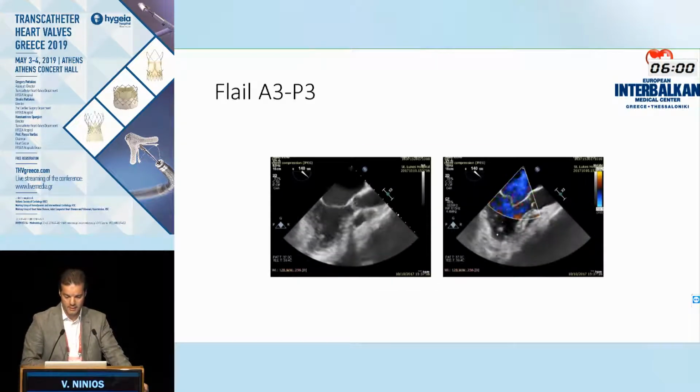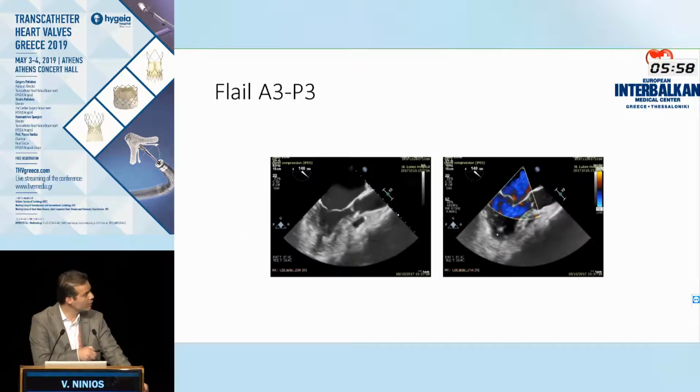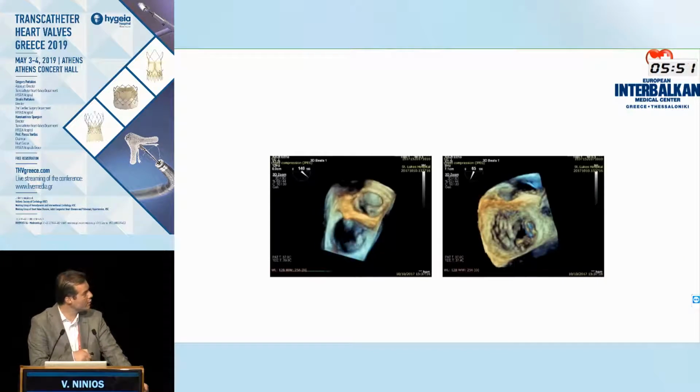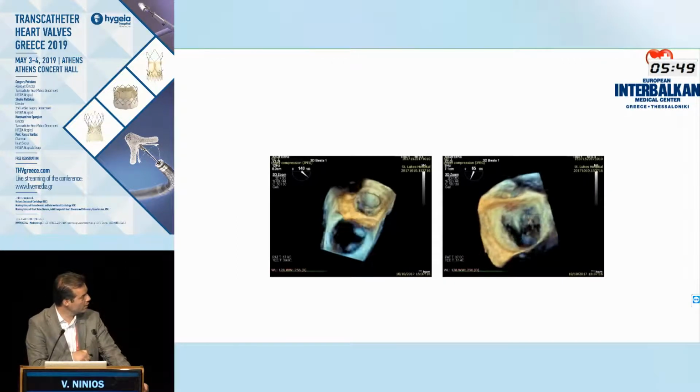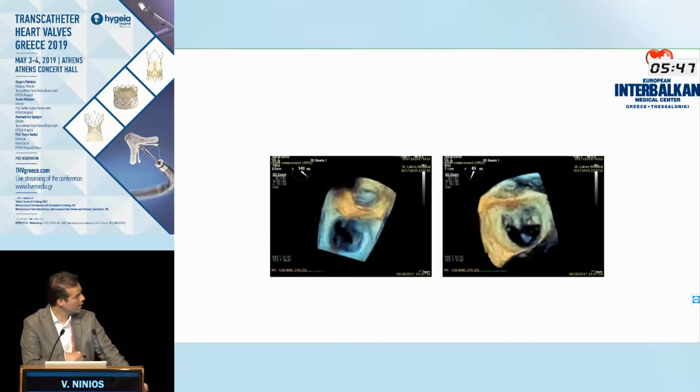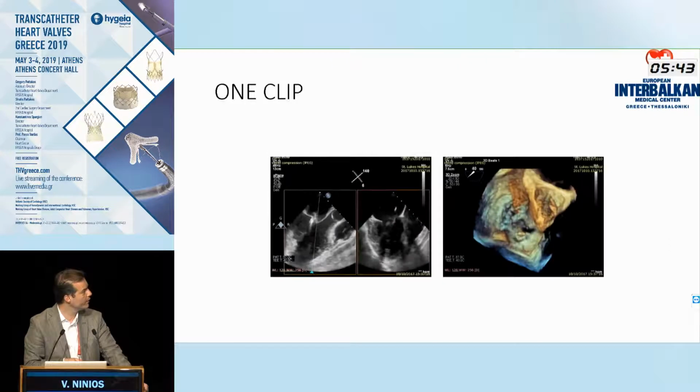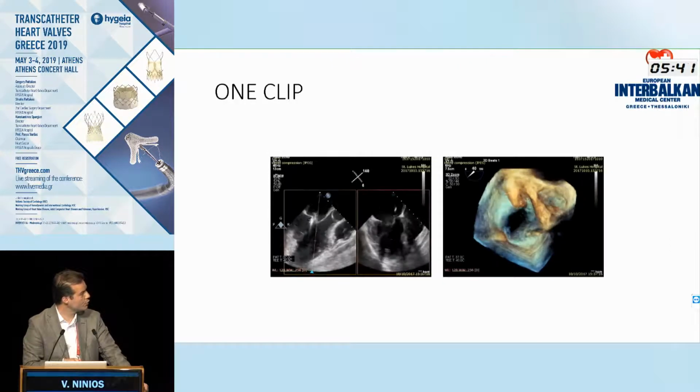Here is another case. This is a truly flail valve. You can see with the vena, with a PISA here on the long axis, that this is a severe mitral regurgitation, and actually the whole medial commissure here is totally ripped apart. You can see that there is a lot of flail tissue. The first clip goes straight on the commissure.